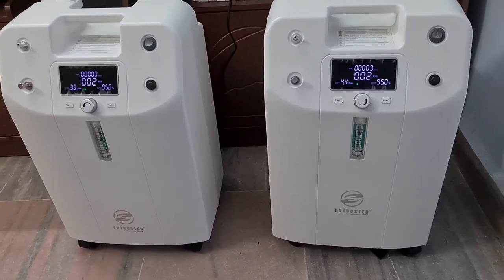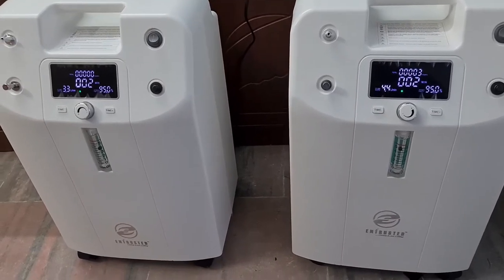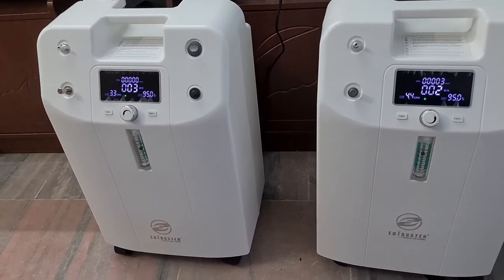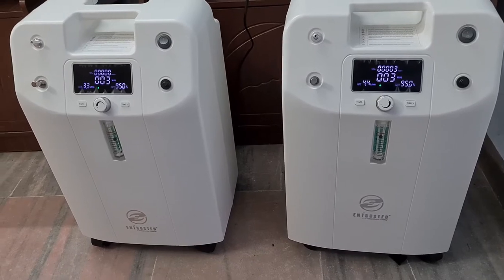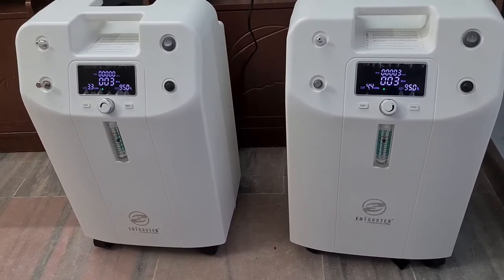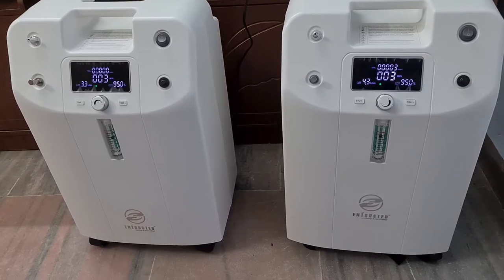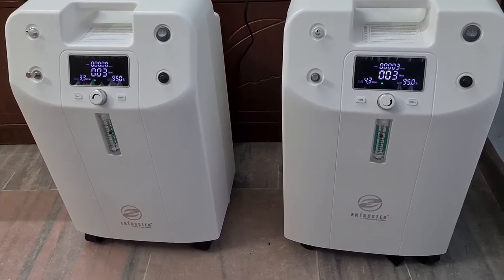The 5-liter machines can run on a 1.5 kVA inverter, whereas a 10-liter equipment requires a much higher inverter capacity, which is really out of budget. So it is always better to go for two 5-liter machines for domestic use. Hospitals will obviously go for standalone 10-liter machines since the usage there is completely different.